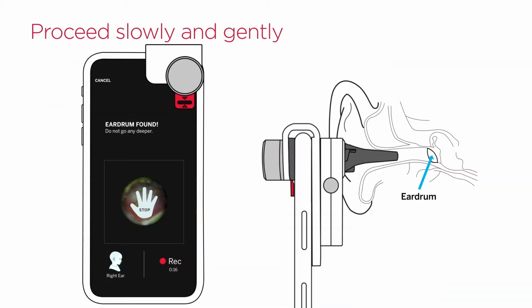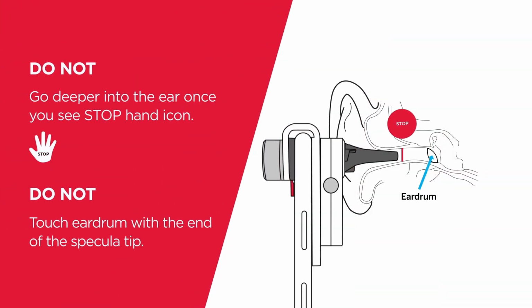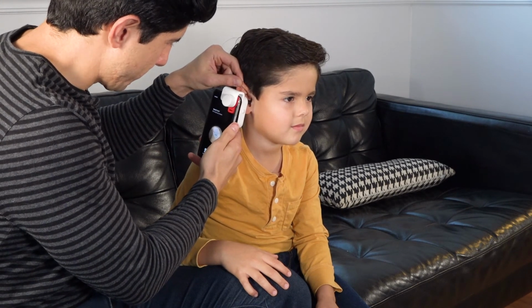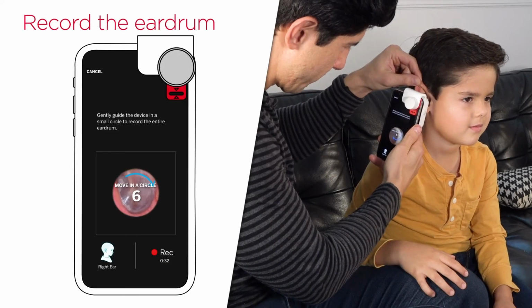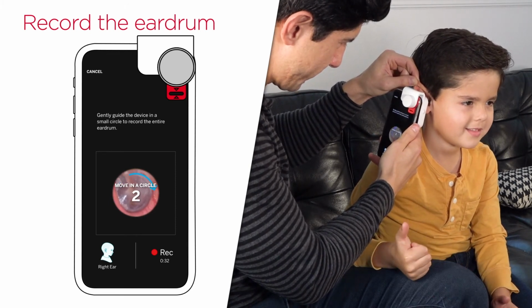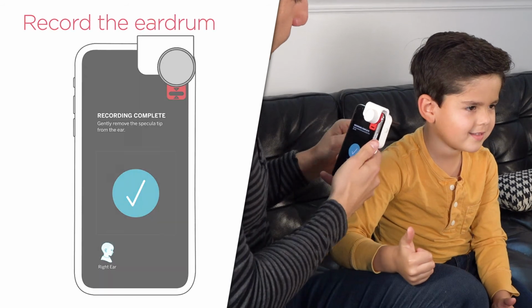Once you see the stop hand icon, do not go any deeper. The eardrum has been found and the app will begin an automatic countdown. Gently move the specula tip in a circular motion like this to record a view of the entire eardrum. The recording will end automatically after 6 seconds.